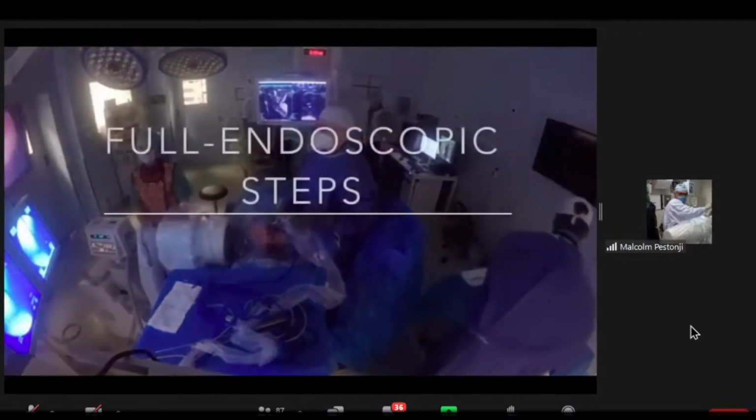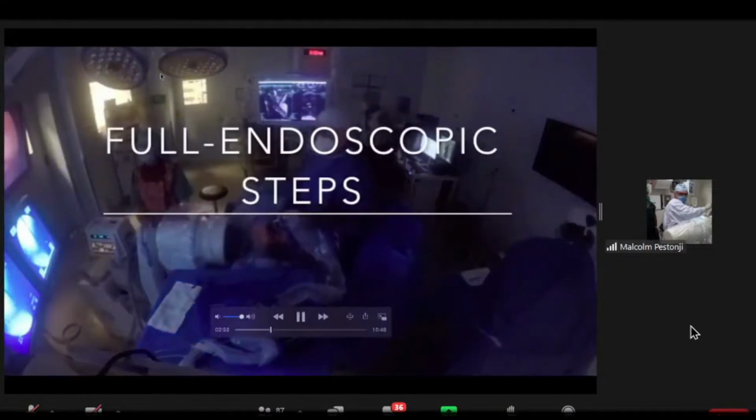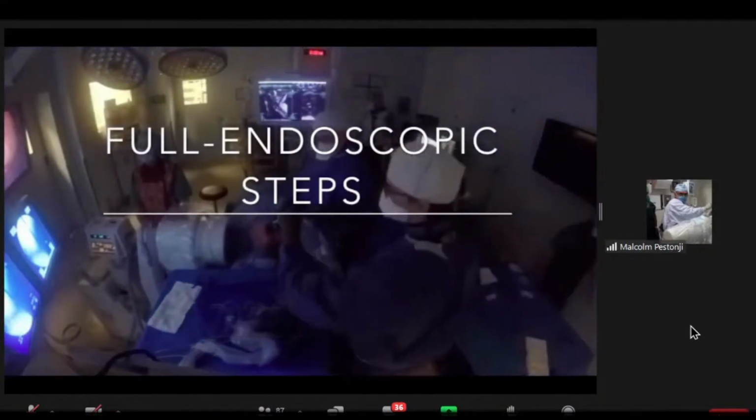Now the endoscope is moved inside the working channel. On this lateral fluoroscopic view, we can see that our endoscope is targeted at the correct level where our pathology exists. On the endoscopy video, you will see this image for orientation. 12 o'clock is towards the midline, 3 o'clock is towards the feet of the patient, 6 o'clock is lateral, and 9 o'clock is cranial, towards the head of the patient.